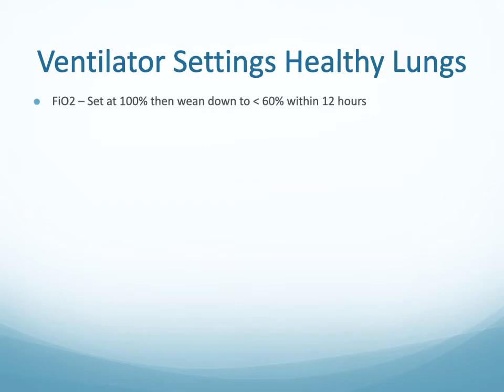Your fraction of inspired oxygen, initially everything gets set at 100%, but you need to wean down very quickly to less than 60% within 12 hours. Oxygen toxicity is a real thing. It causes alveoli damage, and so you don't want to have them on 100% oxygen for a long time. The ideal fraction of inspired oxygen once they're stable is somewhere between 21 and 40%.